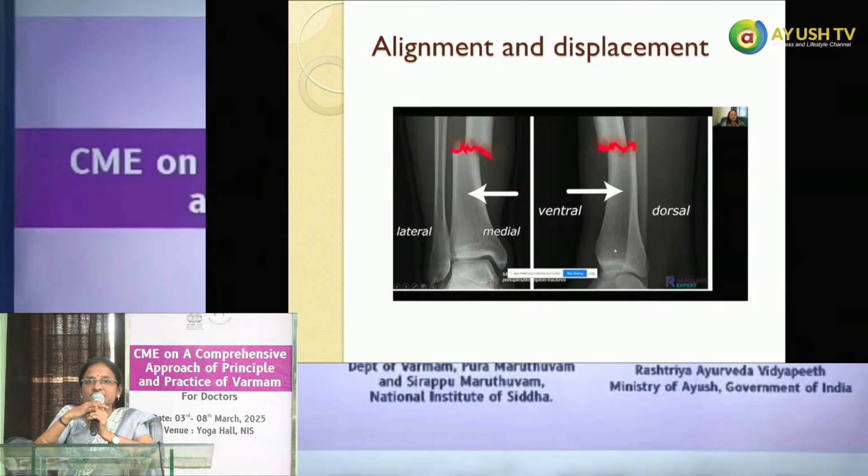called as displaced fracture. So here X-ray of the ankle joint AP view, அதில் வந்து fibula and tibia are seen. Tibia bone la there is a fracture and the red line shows that the fracture line la distal fragment to மேல இருக்கிற fragment segment to they are not straight, it's slightly moved. So if it moves closer to the body it is medial displacement, on the side move ஆயிடுச்சுன்னா it is called as lateral displacement. So these two are alignment and displacement.